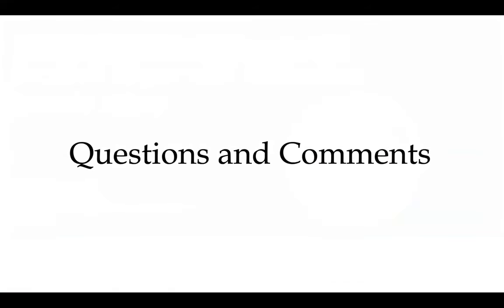All right. Well, that ends the video. So now I'll just start out with some comments about this. I found this a very helpful presentation and lecture, just because there's really not that much literature on the topic of abdominal or oblique strains, especially evaluating these injuries with ultrasound.